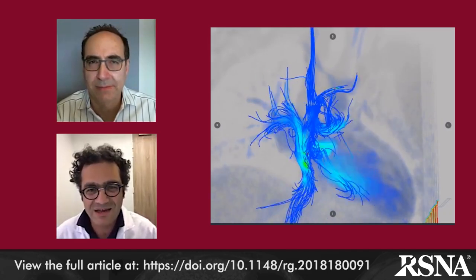But concerning the Fontan operation, you have tons of papers coming out, because it is very interesting. The 4D flow shows where the blood from the superior vena cava goes to the pulmonary arteries, and the distribution, and you can see if there is harmonious or not harmonious distribution of the blood flow coming from the hepatic veins, which has very important consequences for these patients.